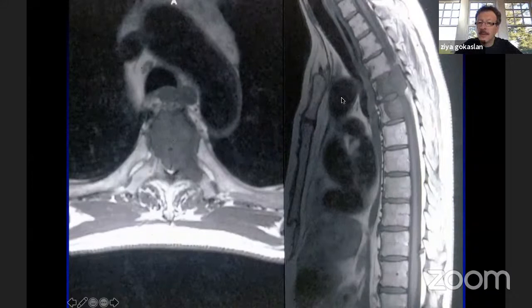You can see the sternum is coming all the way up here. And this is a lesion at the T3-4 level. This is a patient with colon cancer involving two vertebral bodies. And you can see the aortic arch up here. Both of those structures are going to be in the way to get adequate exposure to do this operation from anteriorly through a midline approach. So it's a good habit to look at these mid-sagittal images on the MRI scan or the CAT scan to see how these critical structures relate to pathologies that may be anteriorly situated.